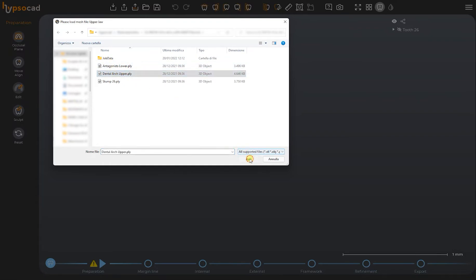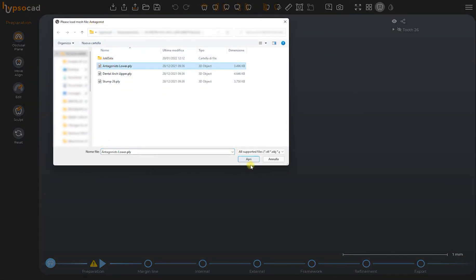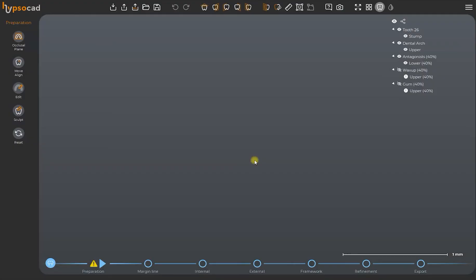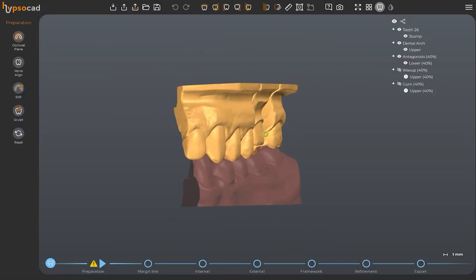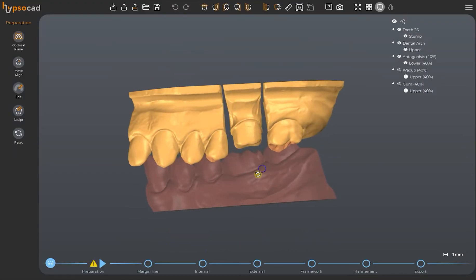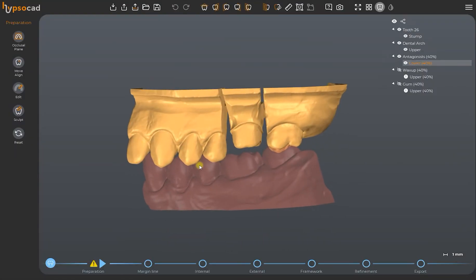Once added to the folder we select the requested files one by one at the top of the folder and we confirm by clicking on open. Once all the files have been imported correctly we will switch to the CAD section of the software.